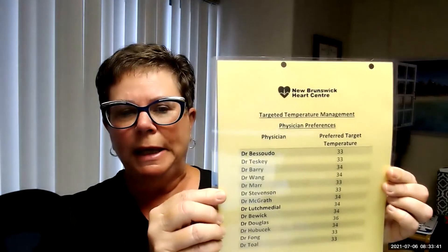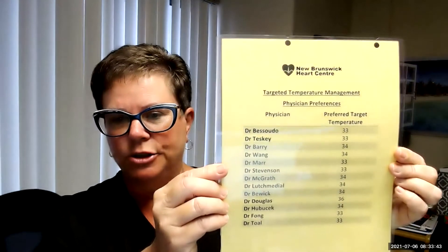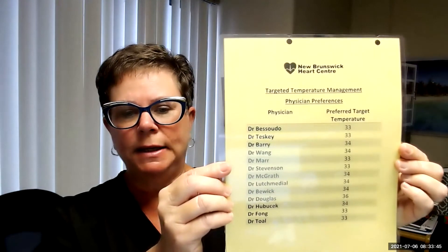So let me just go over a few features. So first of all, this will be in the basket attached to the device and it is all of our physicians and their preferred target temperature. So it defaults to 33 degrees. So if you have a physician who wants a different temperature, you're going to have to go to the little temperature icon and use a plus or minus arrow to change the set point.